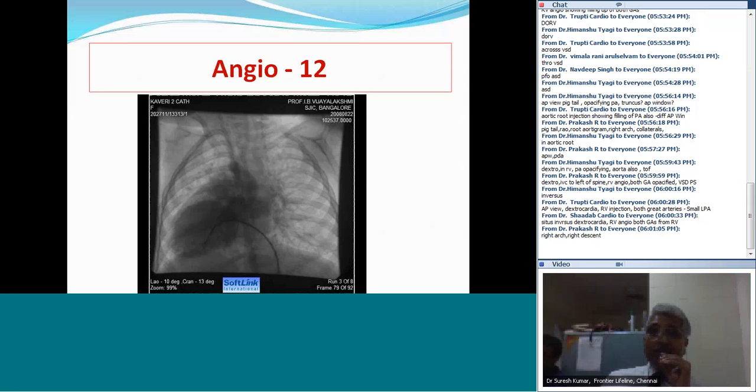With the ventriculo-arterial discordance, you are looking at the outflow. There is a valvar stenosis, there is probably infundibular stenosis as well. You are looking at the integrity of the ventricular septum. See that through a small VSD, the RV is being opacified. So there is a restrictive VSD. And having seen the ventriculo-arterial discordance, you can confirm the position of the great vessels by looking at the position of the pulmonary valve and the pigtail loop. You find that the aorta is right and anterior.